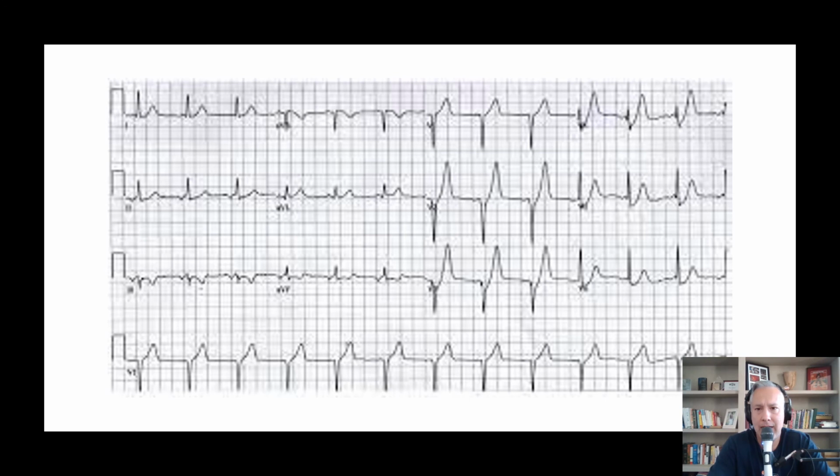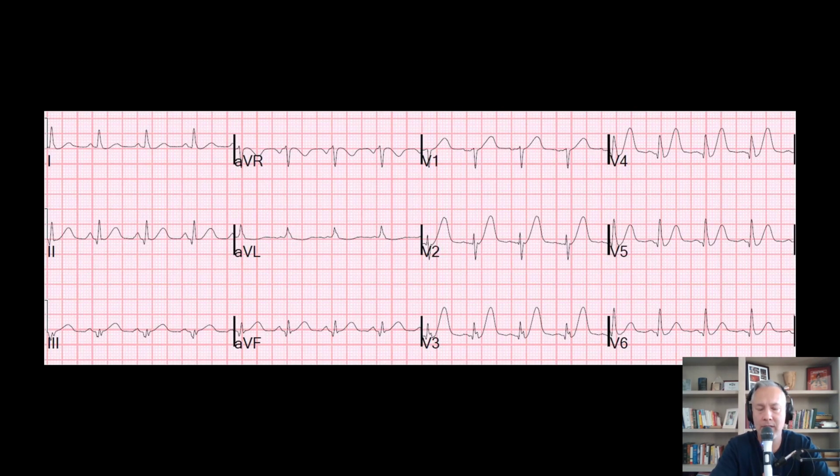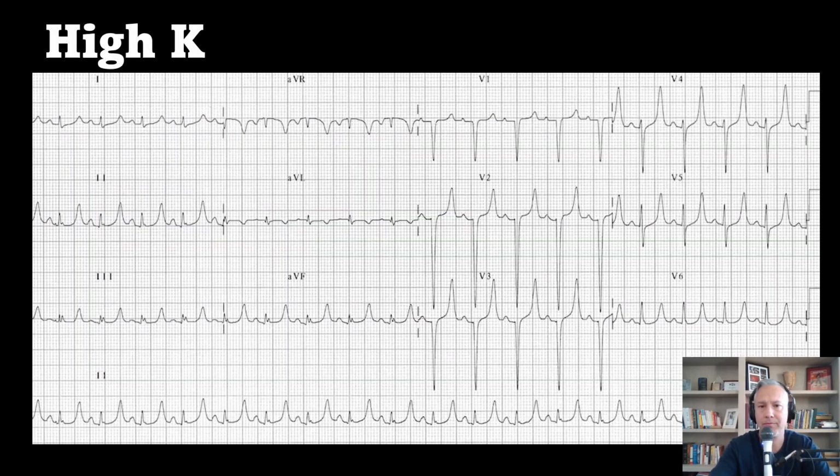Here is a sign. This could be confused for hyperkalemia, right? Because we all learn tall peaked T waves of hyper K. But you see this has depression and it goes into a tall T wave. Think occlusion. Once again, big, fat, wide-base T waves, taller than the QRS. This patient had a 100% LAD occlusion.